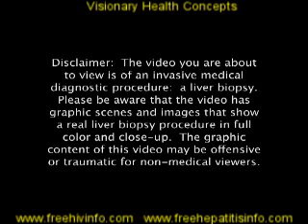Disclaimer: the video you are about to view is an invasive medical diagnostic procedure, a liver biopsy. Please be aware that the video has graphic scenes and images that show a real liver biopsy procedure in full color and close-up. The graphic content of this video may be offensive or traumatic to non-medical viewers.